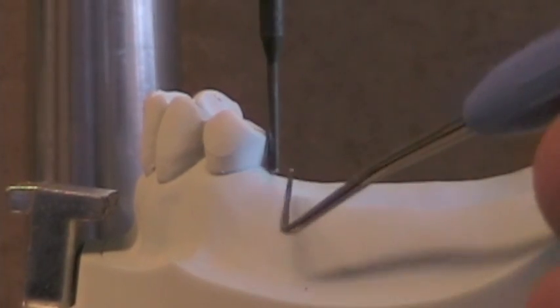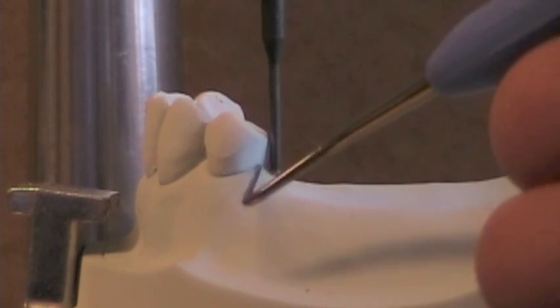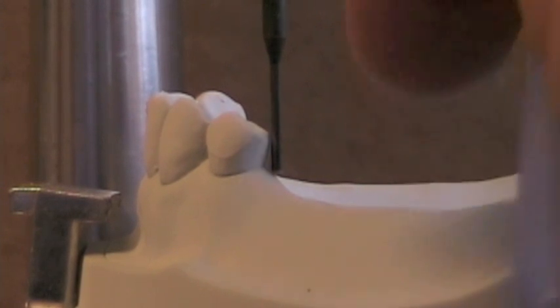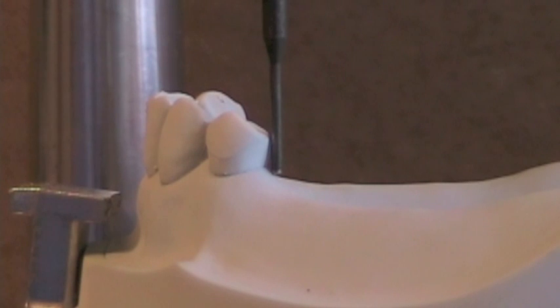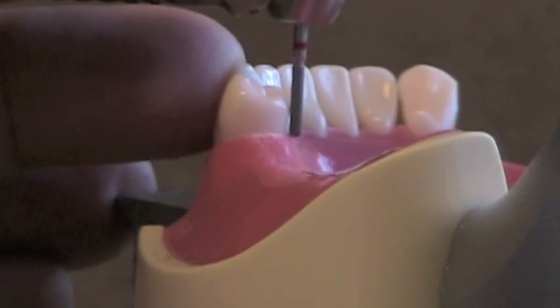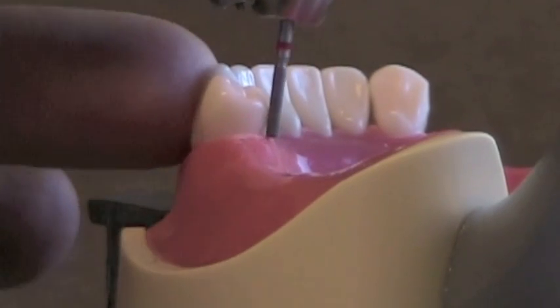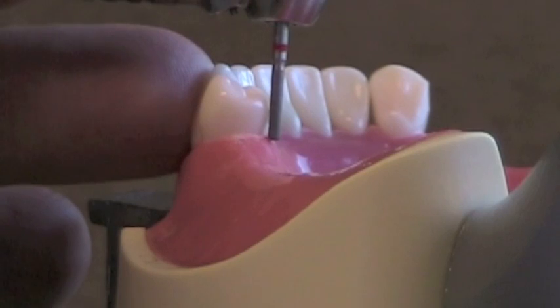Here we're looking back at our cast, and this is what you do clinically — you look back and forth between the cast. Take a look again to see how much space you have when touching the analyzing rod, and how much space there is between that analyzing rod and the tooth at the free gingival margin.